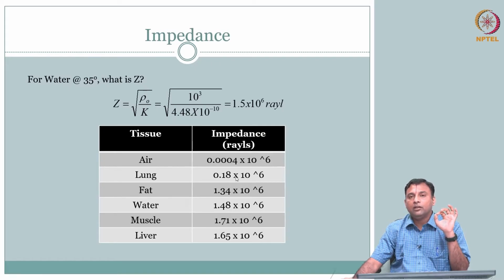In fact, it is useful for the vast majority of clinical applications, but you will notice that for some applications, for example lung imaging or seeing inside the lung, it is usually chest X-ray that is used to detect lung nodules or whatever. Ultrasound is not that popular. You are going to see the effect of that. That is because of this huge impedance difference between lung, air and the other materials in the body. So we will just leave it, recognize that here, but we will come to it in the subsequent slides.